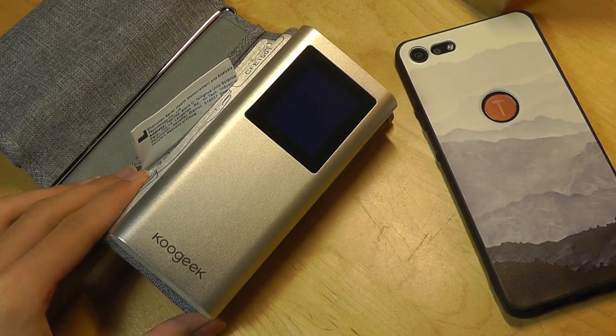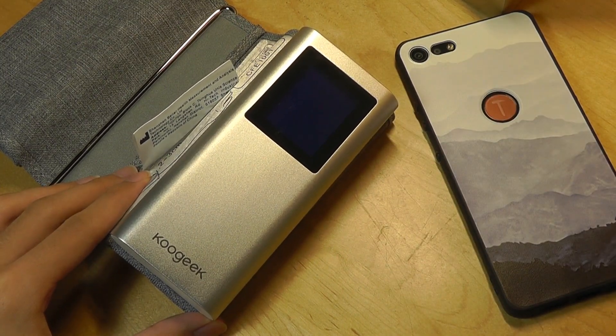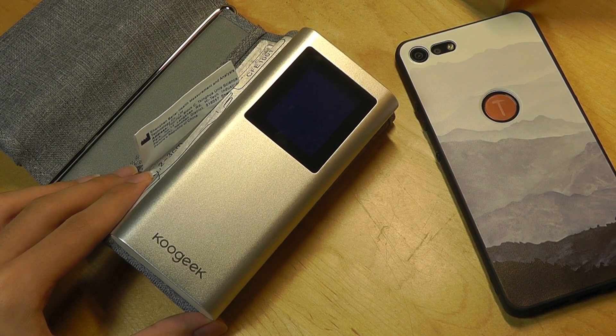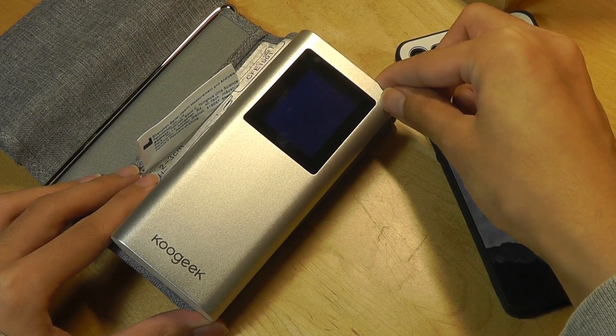One thing I want to point out is that many fitness trackers these days claim to have blood pressure monitoring as a feature, but the majority — 99% of them — are using an algorithm to estimate that. They're basically using your heart rate and then using a conversion table to calculate what most people with that heart rate have for blood pressure. It's not going to be medically as accurate, so if you are really conscious about your health or have high blood pressure, something like this will definitely give you a lot more accuracy than those other wearables.